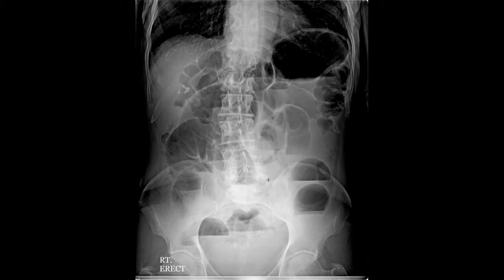Here we have high subject contrast. We have a very light structure, that's the fluid, and we have a very dark structure, that's the air. This is a characteristic of an air fluid level that indicates bowel obstruction. Okay, so this is what an acute abdominal series erect radiograph should look like.